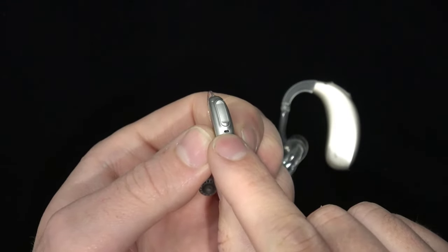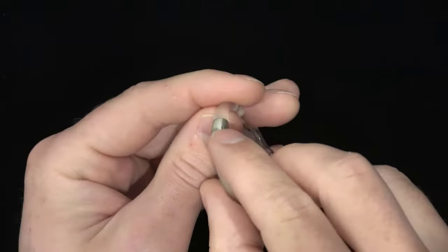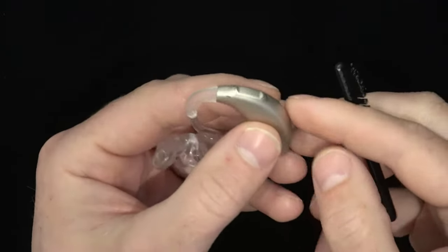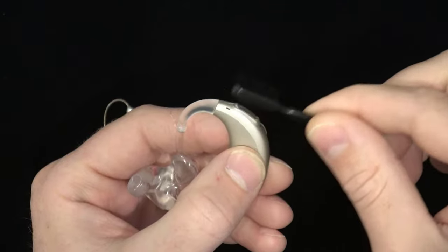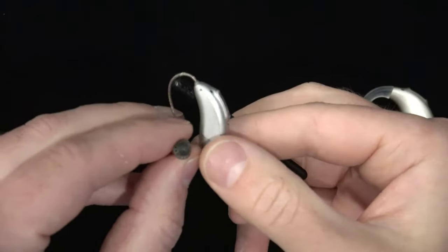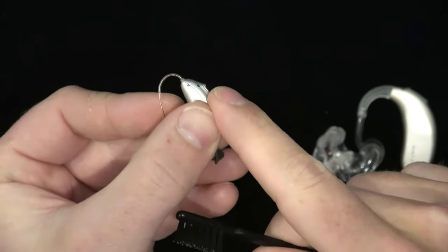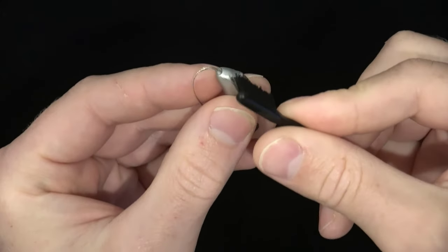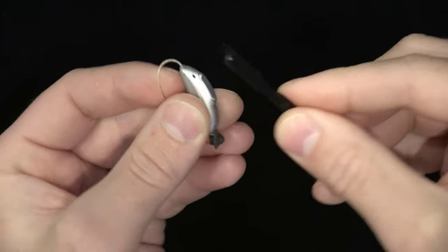Oftentimes these ports are just small openings in the exterior of the device, but some BTE models may have removable and replaceable microphone filters or wind covers. For hearing aids that simply have microphone ports or small openings in the hearing aid casing, take a brush and brush over the openings to clean off any buildup of debris. With this hearing aid in particular — a Phonak Audeo Paradise model — the front-facing microphone ports from the right and left side actually connect to each other, meaning that the bristles of your brush can actually go all the way through from one side to the other, so you can push any dust or debris through the port and out of the hearing aid.